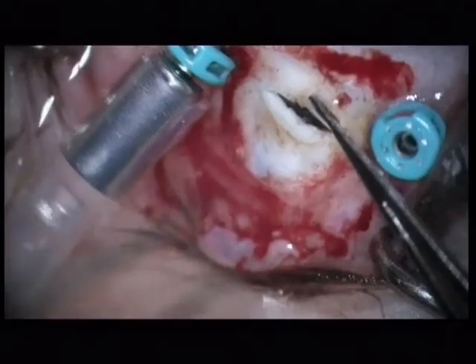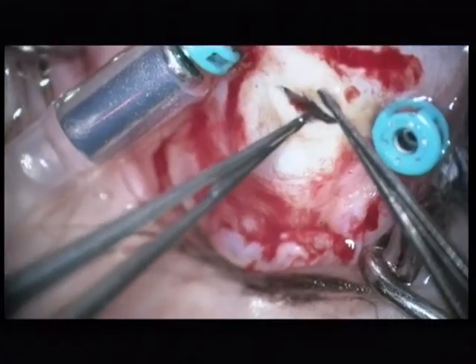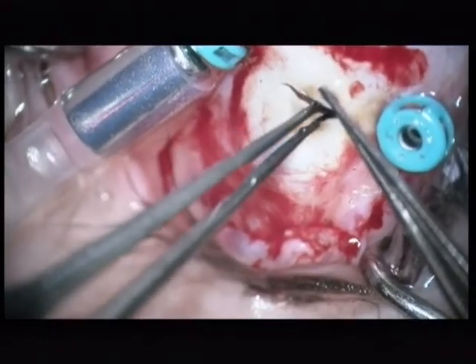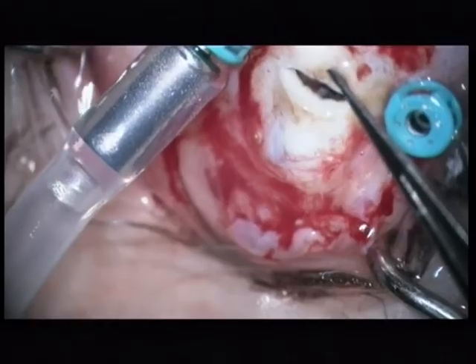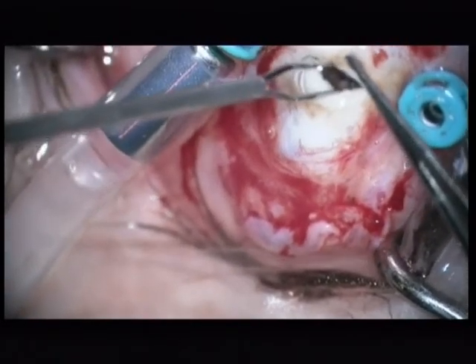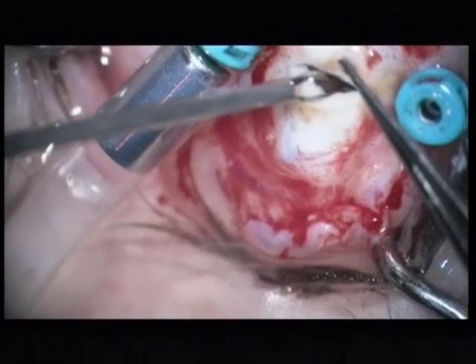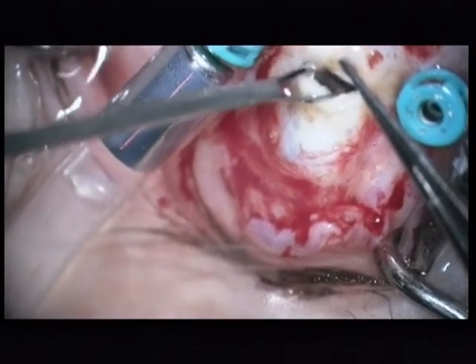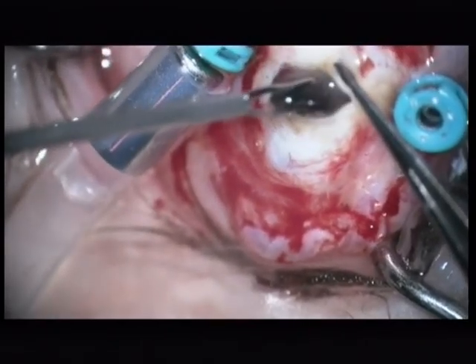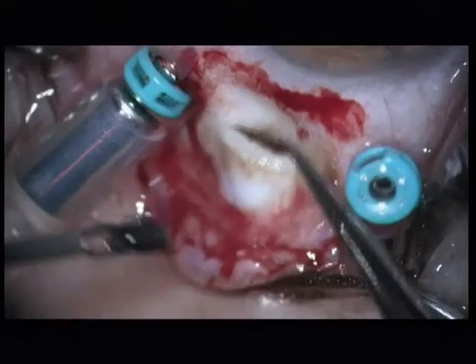So I use forceps with teeth — surgical forceps — and again no success. So I try once more with the 20 gauge foreign body forceps. And again this is my savior — the foreign body forceps. The foreign body is removed.